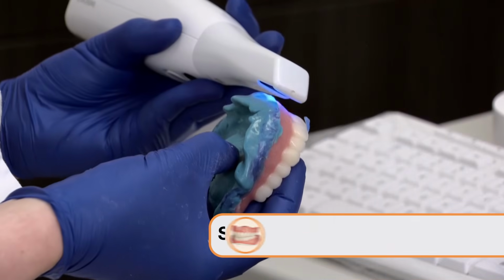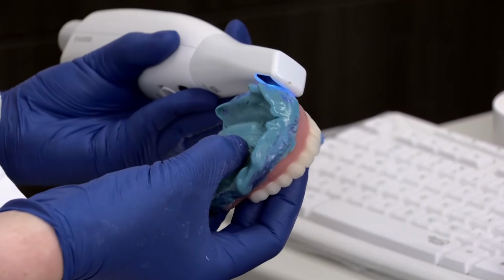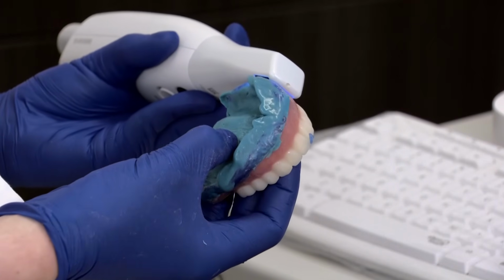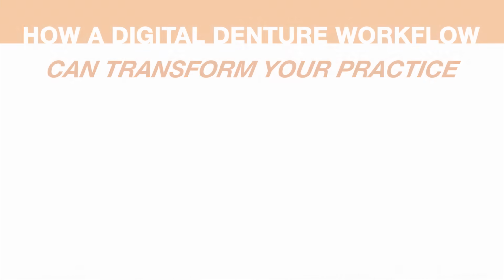The third workflow, the common one that I can think of, would be the patient that comes in with upper and lower, let's say, existing dentures that are worn out a little bit, old. So dentists can take a wash impression and bite registration with both dentures. And you can scan the denture with the intraoral scanner, 360, the intaglio surface as well as the teeth surface, and the bite, and that becomes digitized. So there are several different ways you can get in the digital denture workflow at this time.